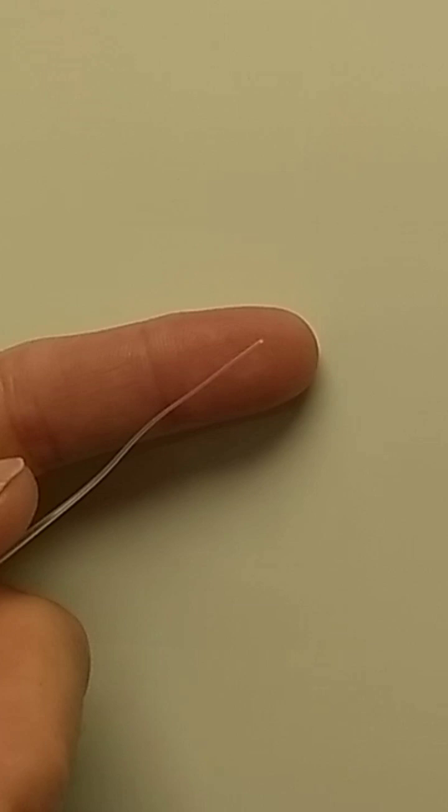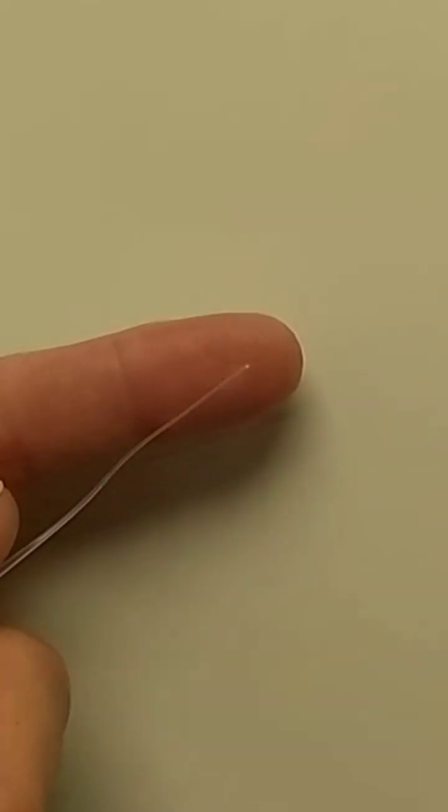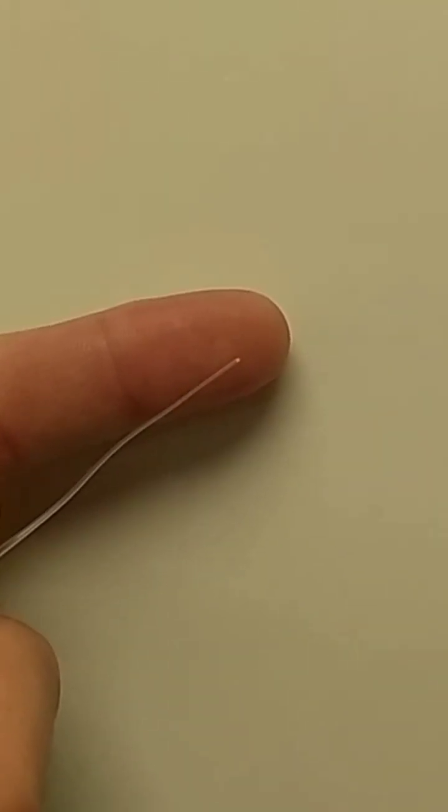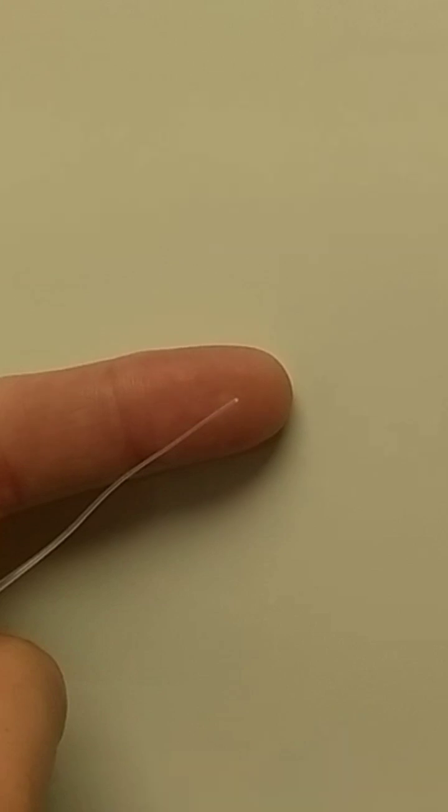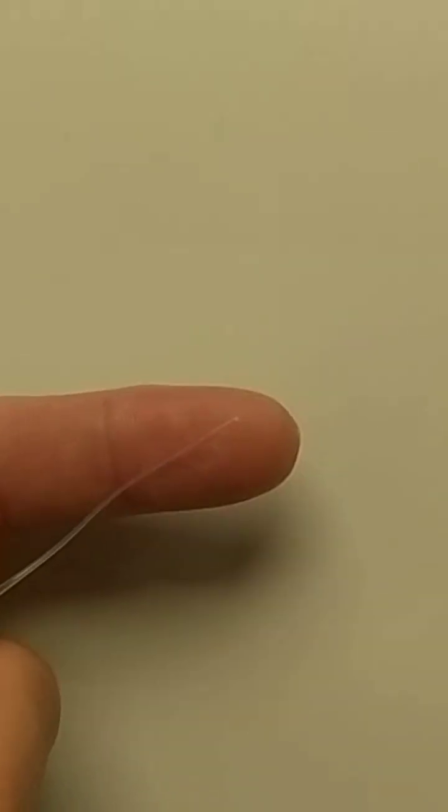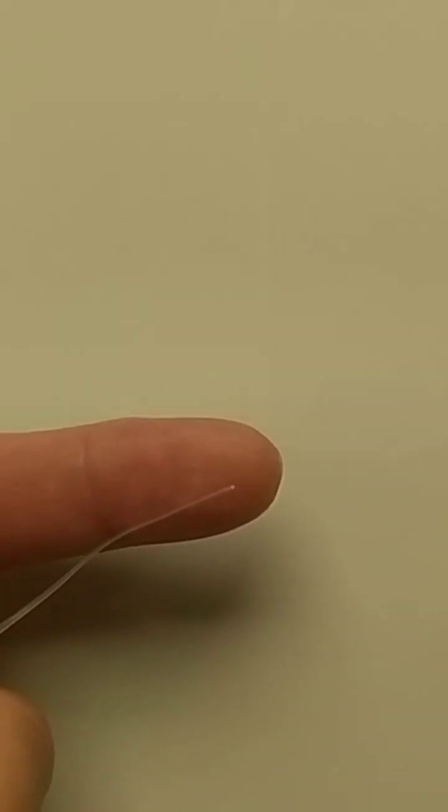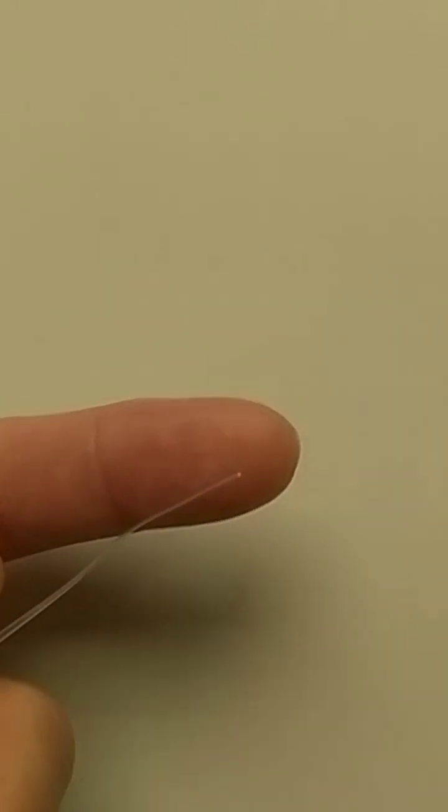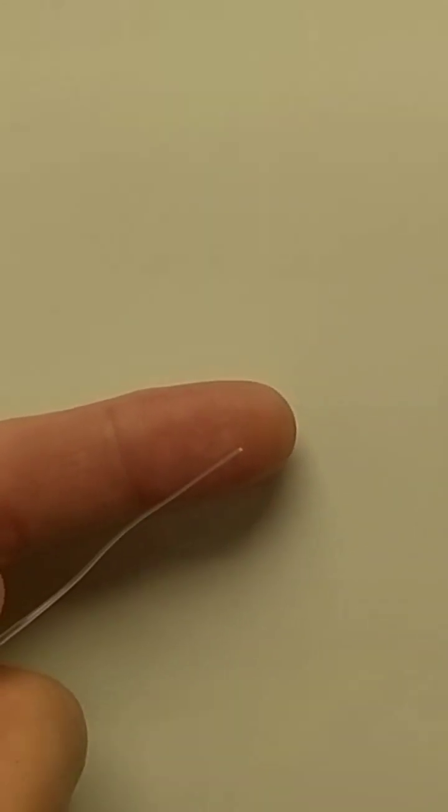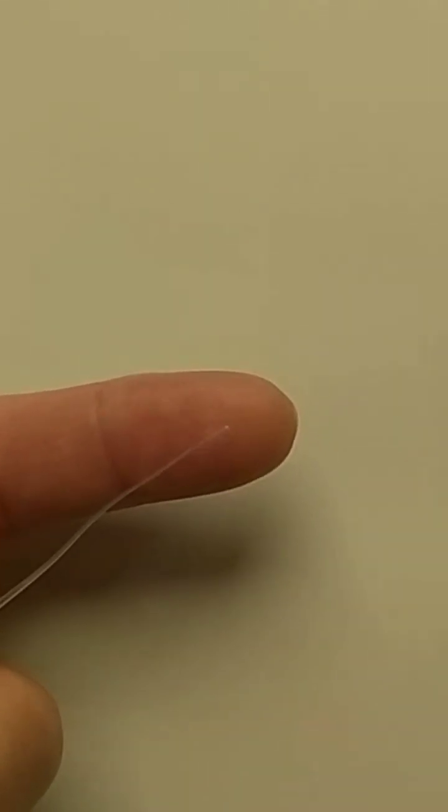It's tapered so you can cut it down to the correct diameter for the nasal opening of the size tortoise you're going to nasal flush for respiratory infection or respiratory irritation. It comes standard with the end at 0.3mm diameter, so it's very small for getting into that nasal entry.